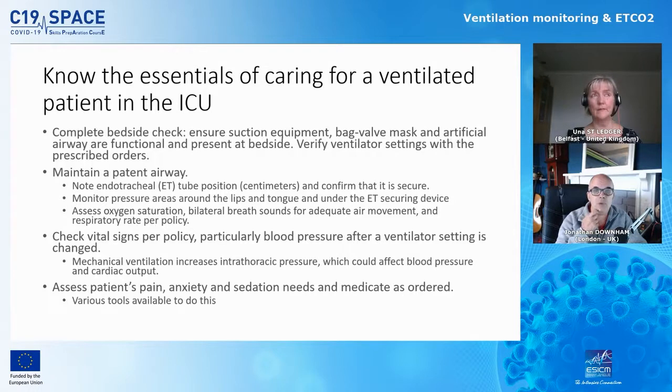You're also going to make sure that the patient is being monitored appropriately. So look at the screen behind them. Does everything seem to be working okay? As the pressures changed, for example, has the blood pressure changed significantly since they were last monitored? Has the heart rate increased? And check your alarm settings as well. Make sure that you're happy that the alarms are set within the boundaries that you are going to accept as being okay for your patient.